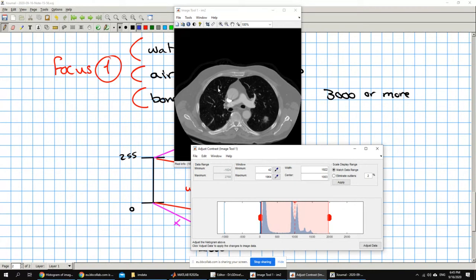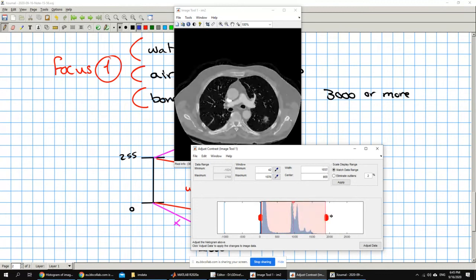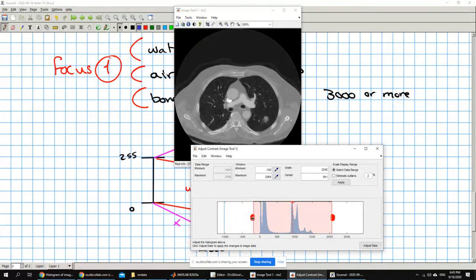And basically, you see some vessels here, but not many vessels. If you focus on the vessels here, you see so many of them. And this is very important, because basically this part here became very clear. It seems like there is something wrong here. This is like a nodule, a lung nodule here that should be detected. When you have it inside the whole range like this, sometimes it can be confused by something else. It's not probably as clear as when you have it in an air window display of the CT image.